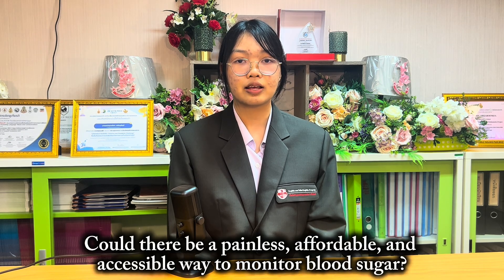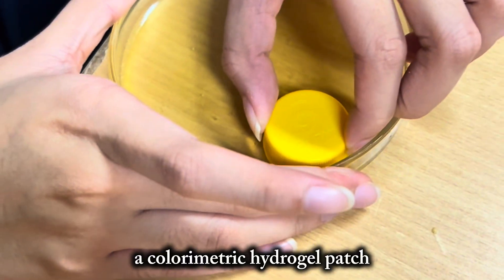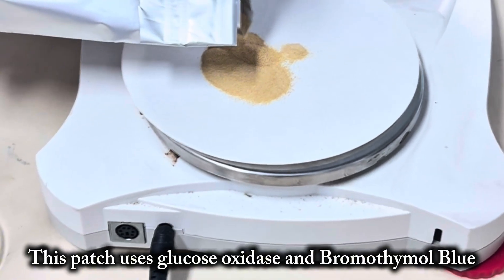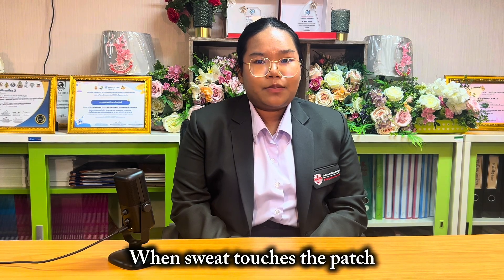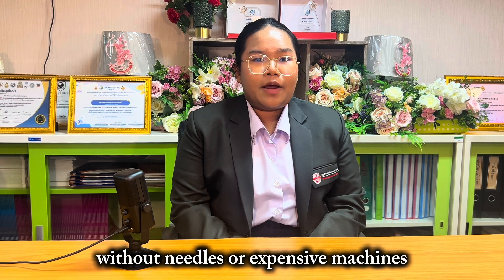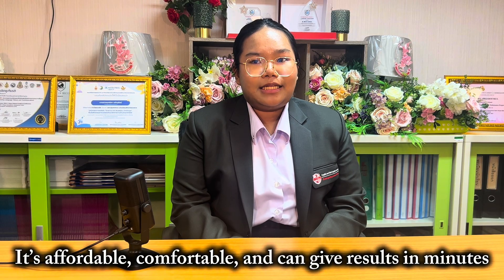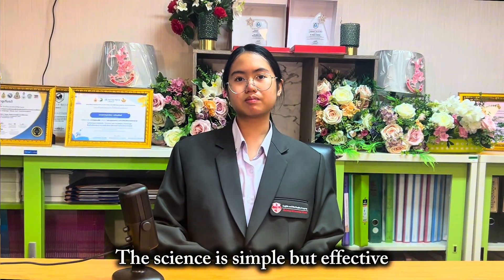We asked ourselves: could there be a painless, affordable and accessible way to monitor blood sugar? Our answer is a color-chromatic hydrogel patch that detects glucose in sweat. This patch uses glucose oxidase and bromothymol blue embedded in a soft, skin-safe hydrogel. When sweat touches the patch, a biochemical reaction changes its color, indicating glucose levels without needles or expensive machines. It's affordable, comfortable, and can give results in minutes, visible to the naked eye.